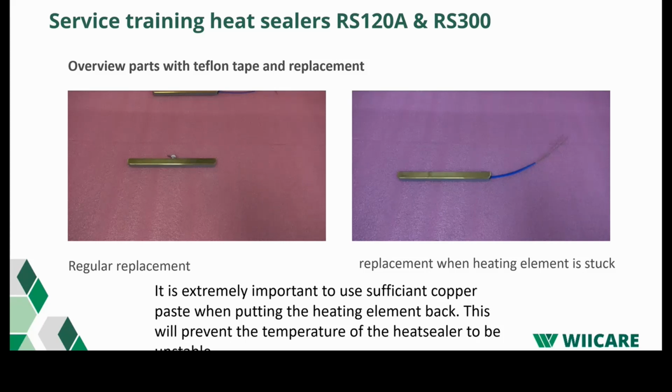When the heating element is really stuck in the heating bar, it can be very difficult to get it out. And when you keep pulling on the wires, you have the chance that they snap off the heating element. So it's better to replace the Teflon as instructed in this video.